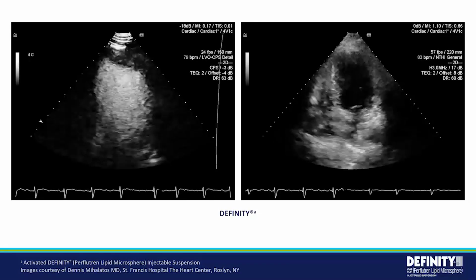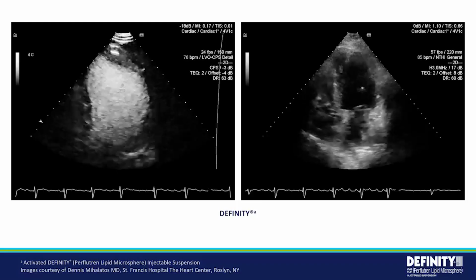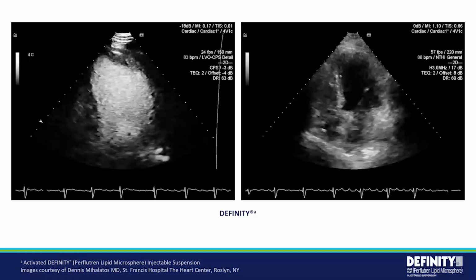This defect in the lateral apical wall on the 4-chamber view is consistent with a thrombus. And this thrombus may not look like your usual thrombi that are pedunculated or moving, but it's more lamellar. And it's important to realize the presence of lamellar thrombi.